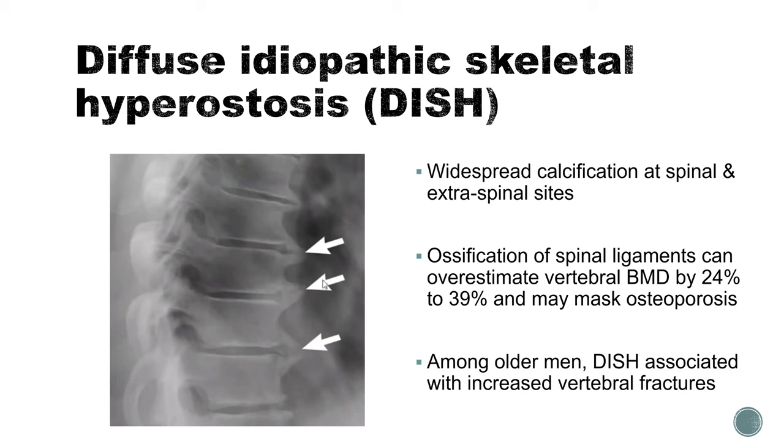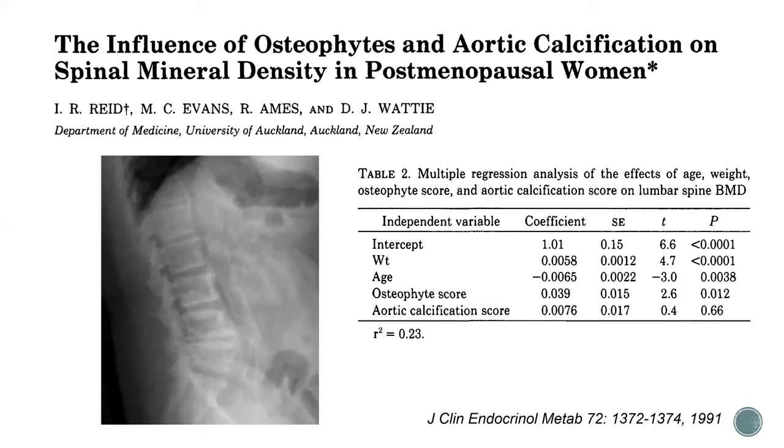But despite this, it can be associated with increased vertebral fractures because the actual bone density within the vertebrae itself could be low, and it's not because the actual reading is falsely elevated.